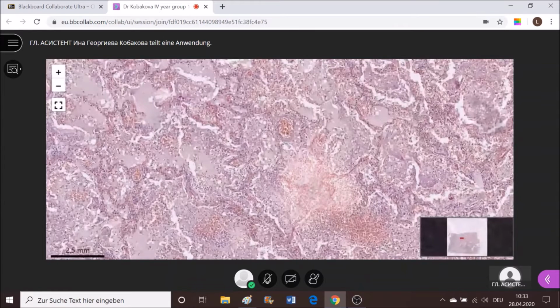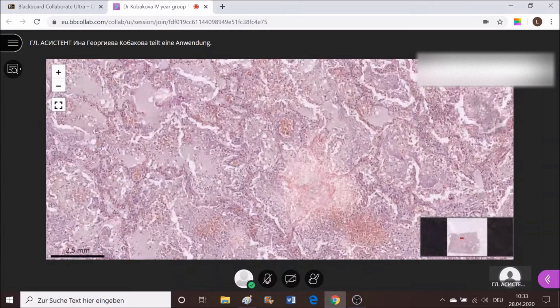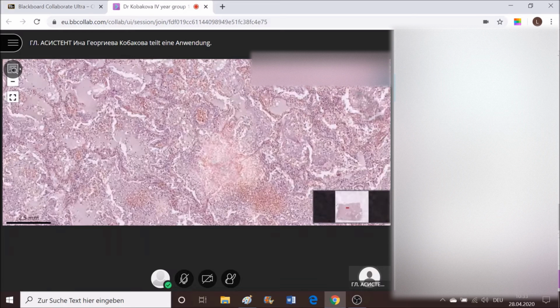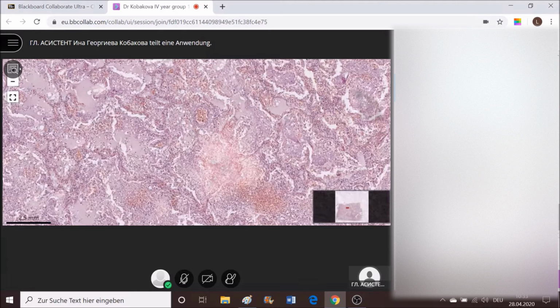Specifically here, I don't see a bronchial epithelium, so I would not call this region filled with bronchi. I would majorly describe this field as alveolar spaces and alveolar septi, which are filled with fluid and inflammatory cells, and there is severe hyperemia in the septi with dilated vessels filled with erythrocytes. With bronchus, not exactly here. I'm going to show you now a bronchus.